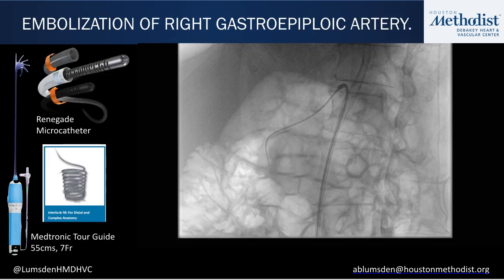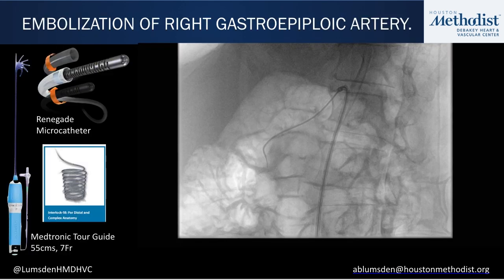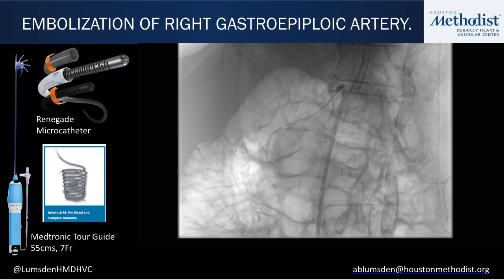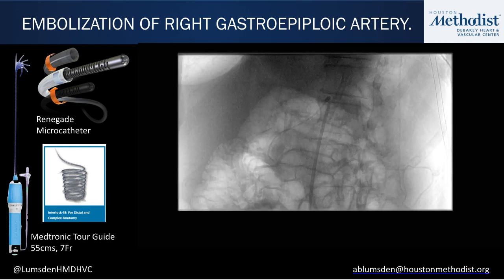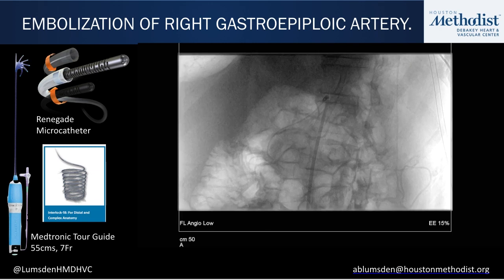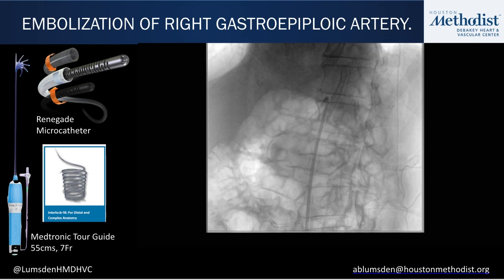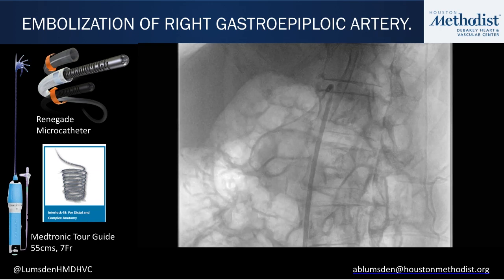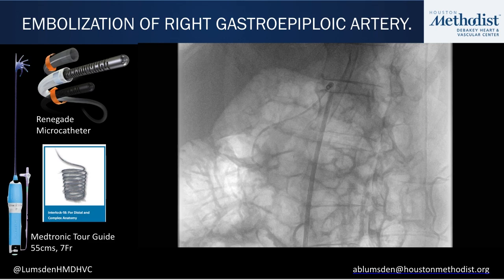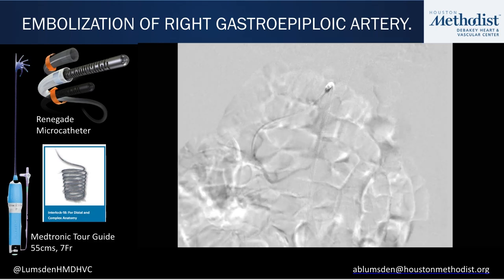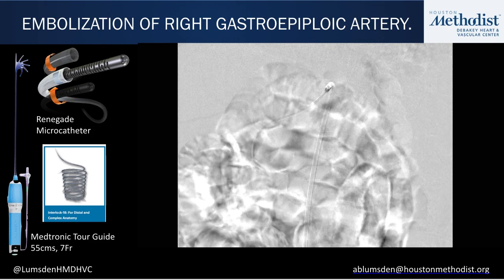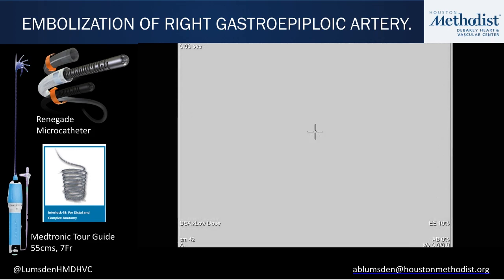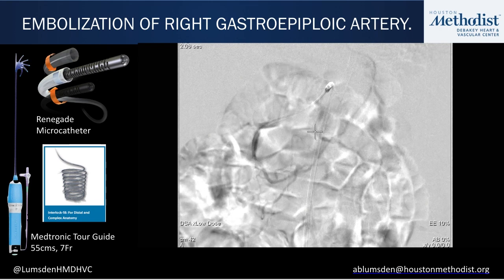Moving on to the procedure: the patient was accessed through the groin, and we accessed the celiac artery using a Tourguide catheter. We were using a 5 French Berenstein. The wire went down the gastroduodenal artery, and we advanced the catheter down into the gastroepiploic artery. We injected contrast and confirmed we were in the right gastroepiploic artery, which can be seen running all the way up along the greater curvature — though we couldn't even see the top end of that artery.